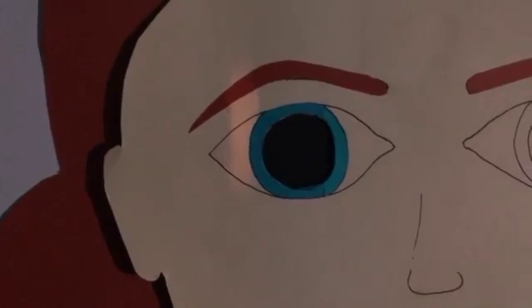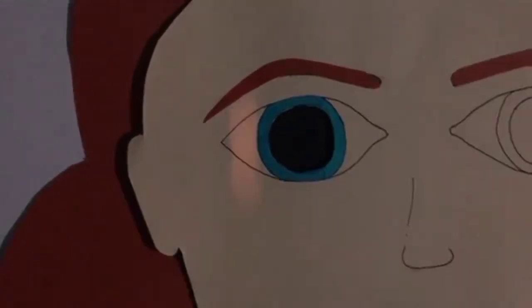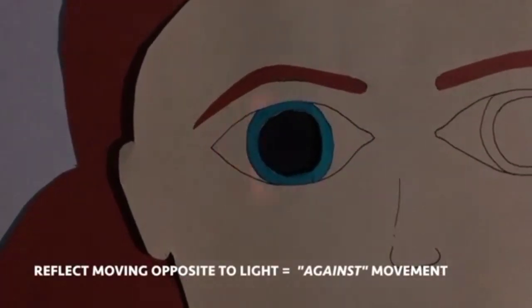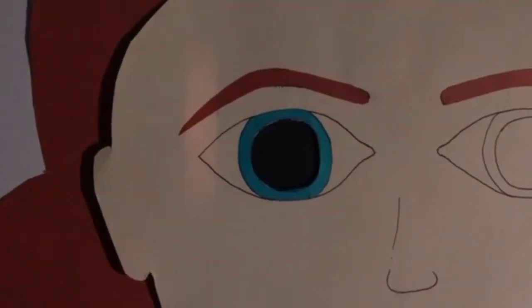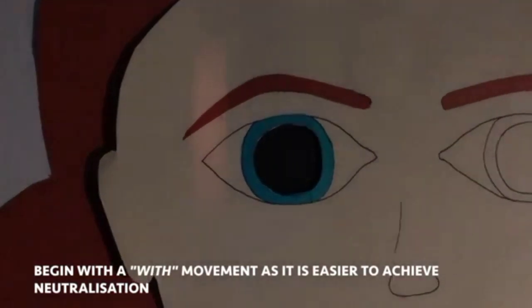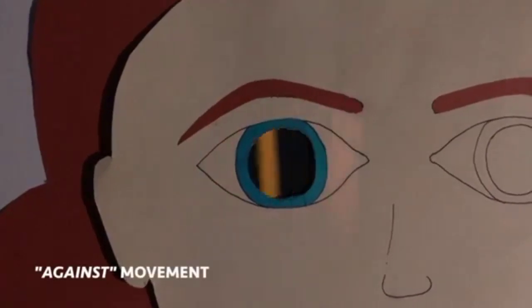If the streak moves with the reflex from the retinoscope, this demonstrates a with movement. If the streak moves opposite to the reflection, this then demonstrates an against movement. When initially beginning the clinical test, it is recommended to begin with a with movement, as this is easier to achieve neutralization. In our patient Ahelia, she demonstrates an against movement.